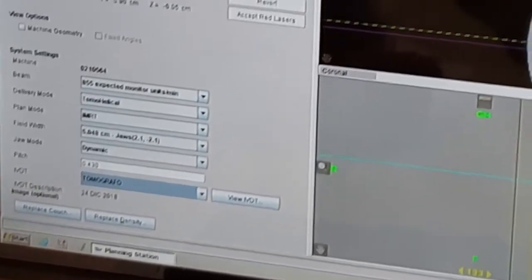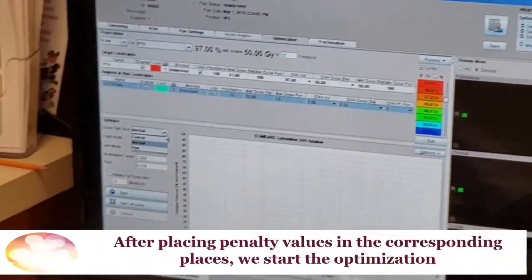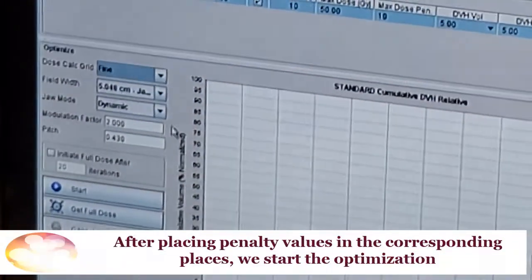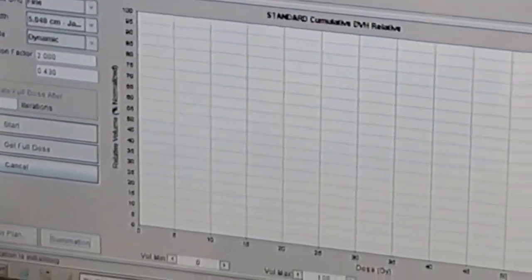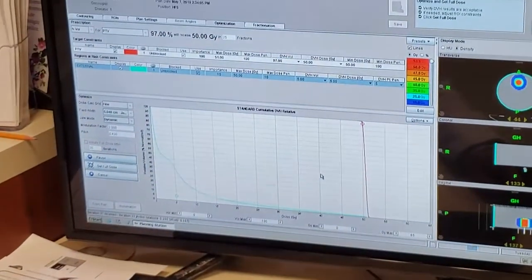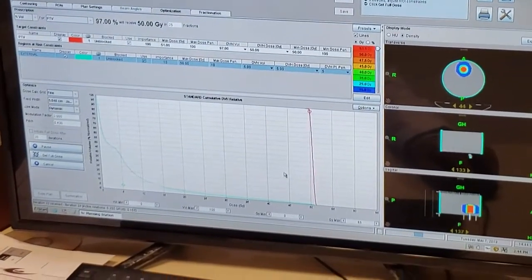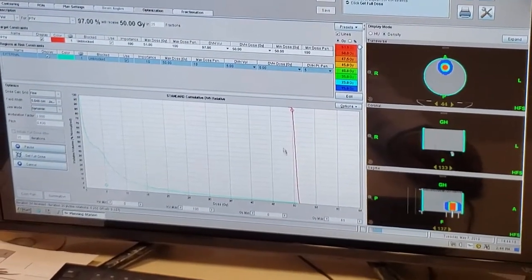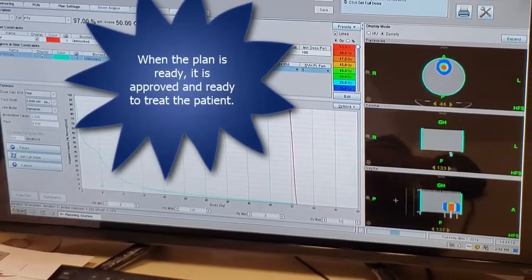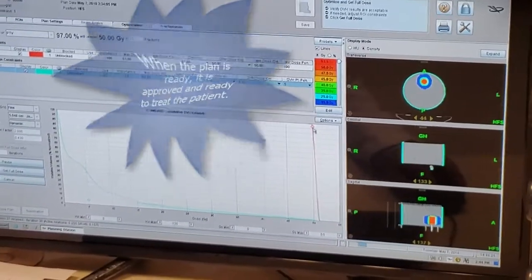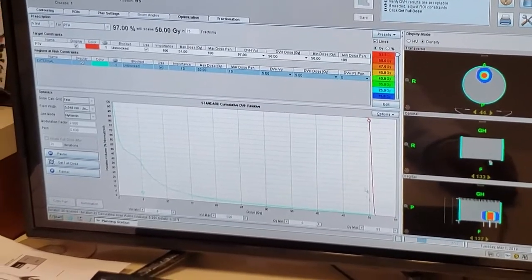We'll head to the optimization part. We place the calculation grid as fine, and we indicate the system to begin calculating. Since it's a basic plan with 33 iterations, we can see good results in our DVH — we see a good gradient and almost perfect coverage.